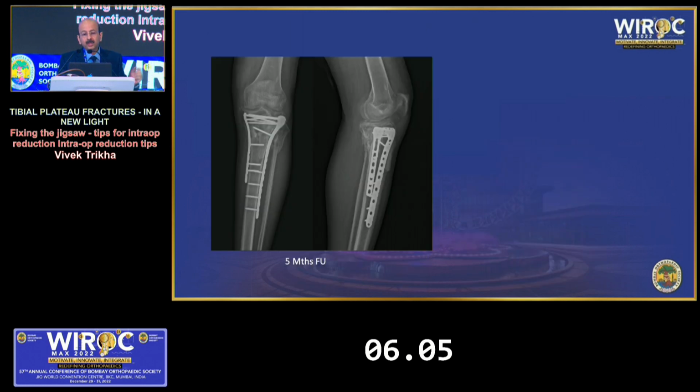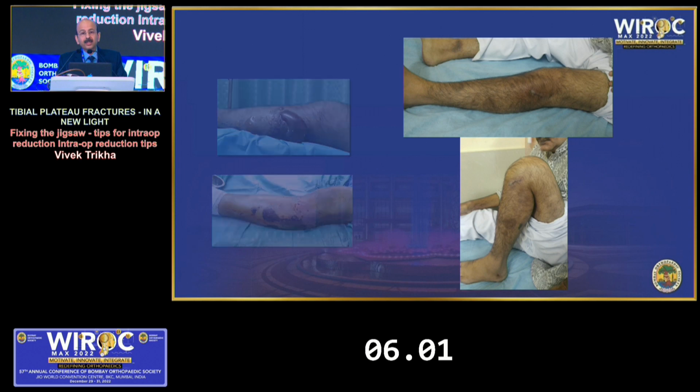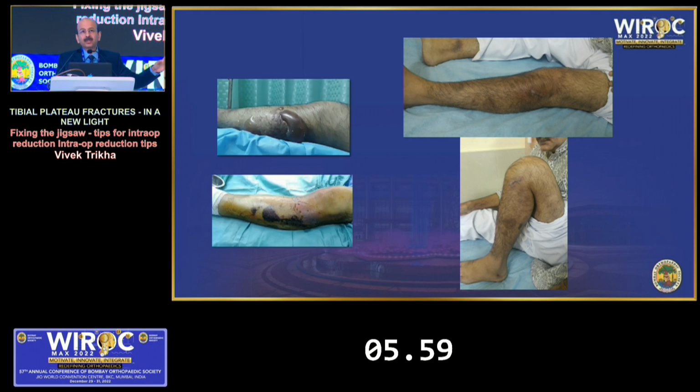Post-op images, 3-5 months follow-up, 15 months follow-up, and these are the patients. The same blisters, the same scarring on the skin, but the results you get are optimal, if you remember how to maintain the alignment, with no pain.